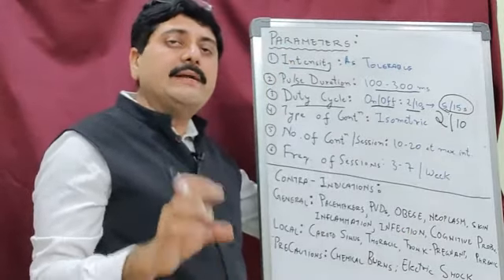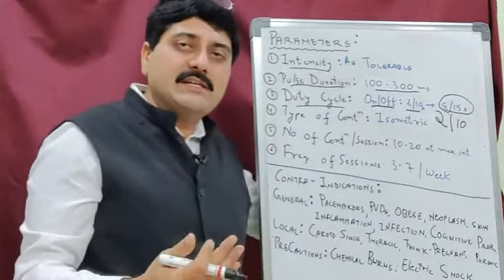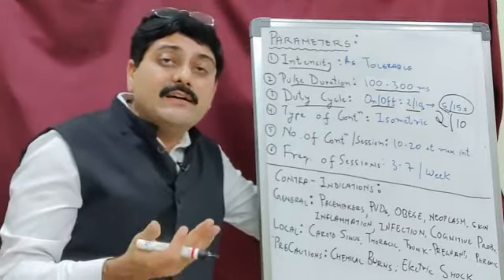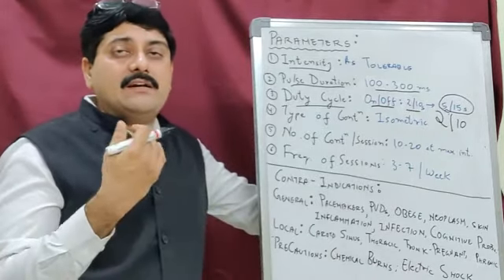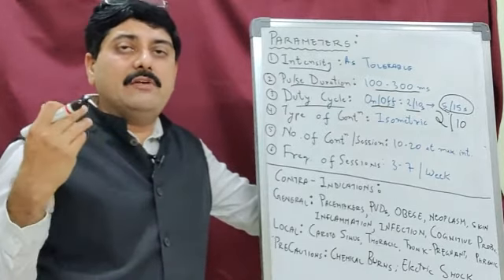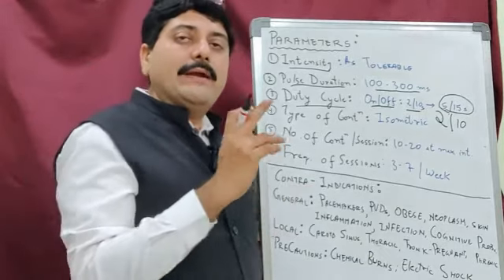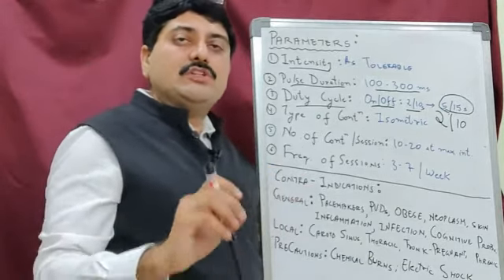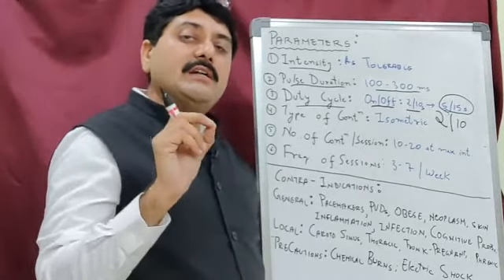This is very important. Do not keep the rest time low so that you can finish the treatment fast. Many a time, because we are in a hurry to free the patient, we tend to do this: we give the contraction, finish the patient and send him off. But this is very important, you have to maintain this, and when you are giving stimulation, you are sitting with the patient at all points of time. You are not leaving the patient unattended.